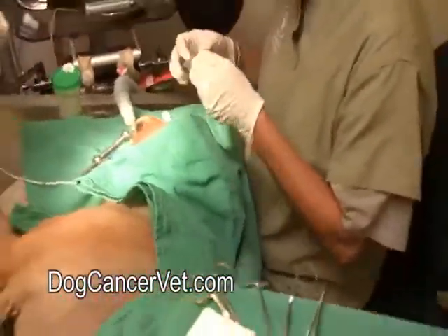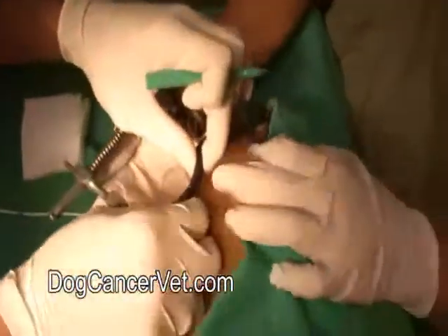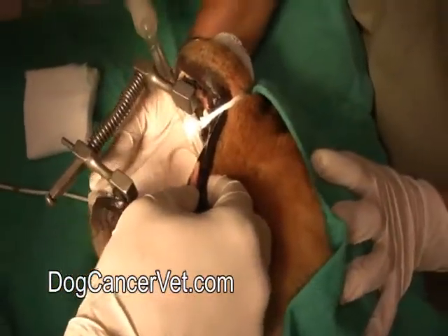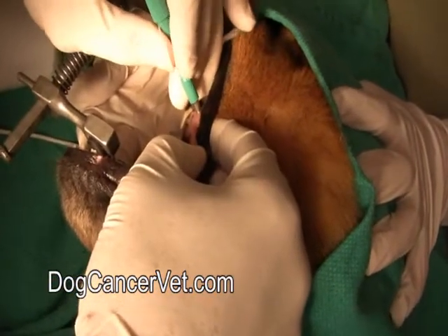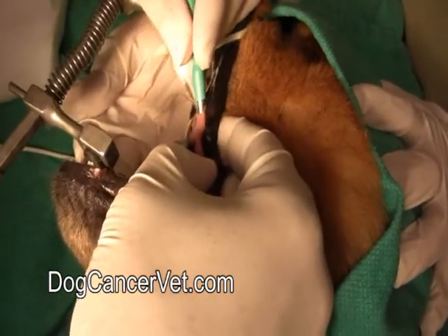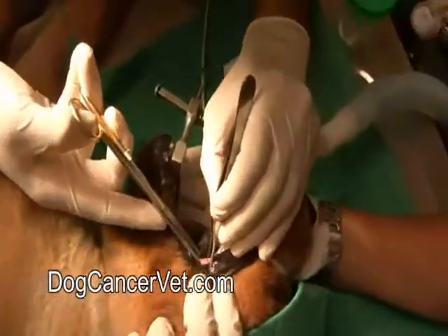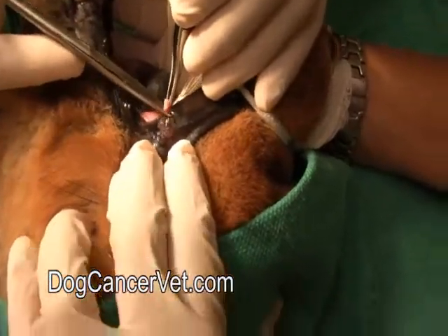Karen, why don't you go ahead and get my biopsy punch for me. We're going to take a little gauze over here and she's going to help by positioning. I need to pick an area that looks like there's going to be some action because I don't want to get a false negative on my biopsy. False negative means the pathologist says they don't see any cancer when actually there is - it means you miss the spot. So we're going to go right there on the edge and just twirl a little bit to make sure that we have some cutting. There's my piece - now I'm just going to remove that with little scissors. I want to make sure that I get it nice and deep, because you don't want to miss any cells that the pathologist might need when they're making the diagnosis.